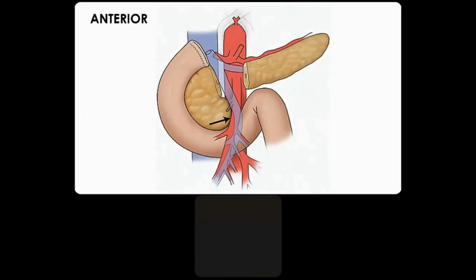When they proceed with the Whipples, they will transect the pancreas there, depending on where the tumor is, of course, and we're usually in that location, and then they'll leave the remainder. That is a critical margin.